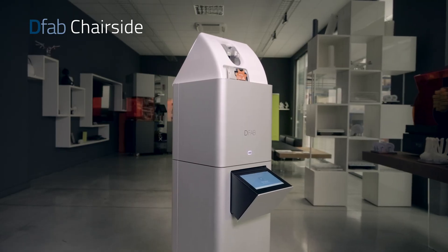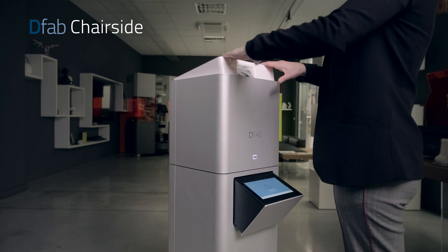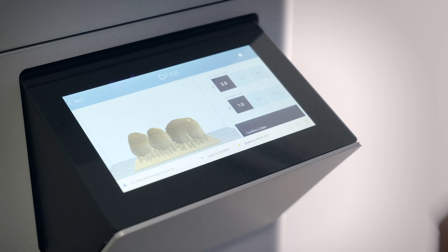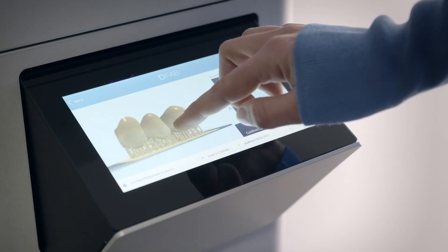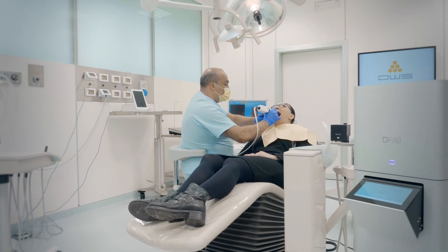The D-Fab chair side, all in one, is completely self-contained and integrates in the elegant aluminum turret all the necessary hardware and software. The integrated touchscreen allows all controls to be set in a practical and intuitive manner, and the convenient wheel design makes it easy to be moved between rooms.